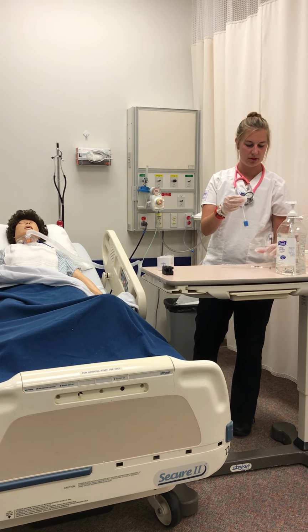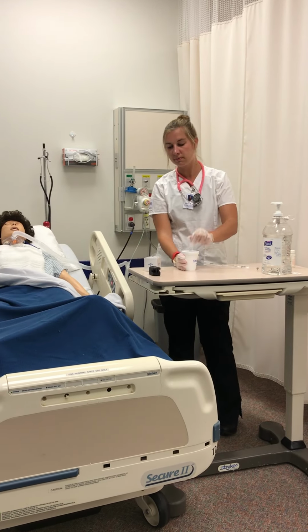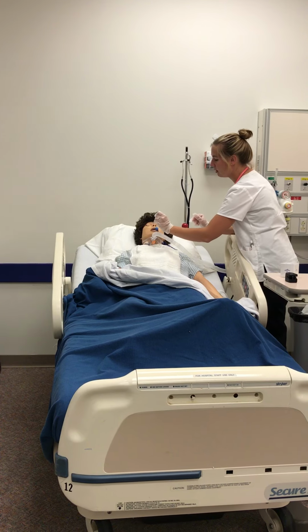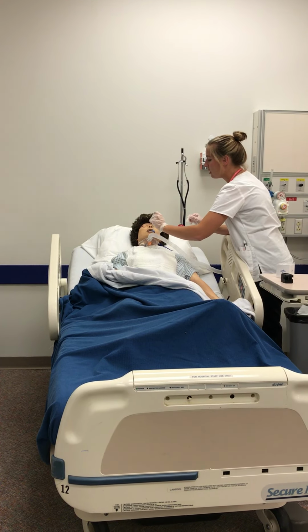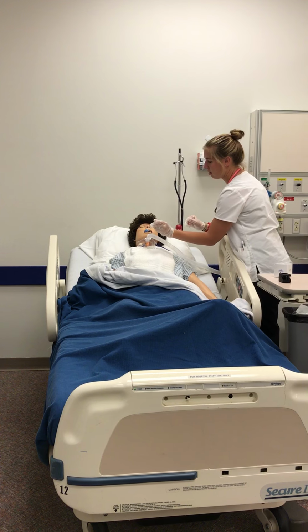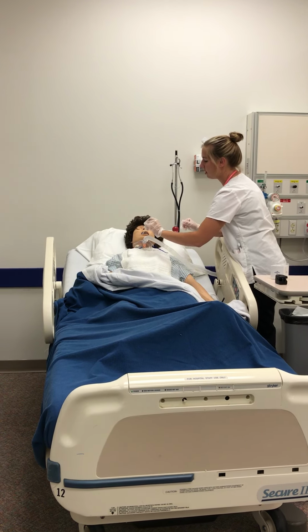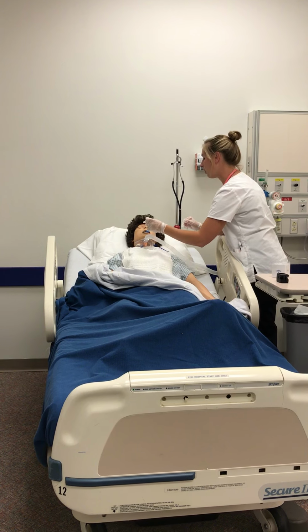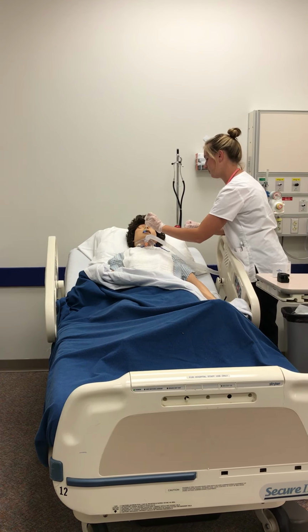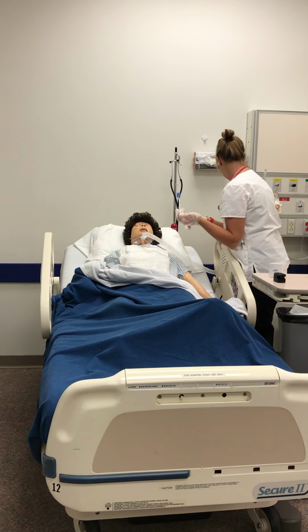I'm going to dip the swab into my glass of water. All right, Gretchen, are you ready? I'm going to swab your mouth. Taking care to go back and forth and around the mouth and clearing out those airways. Great.